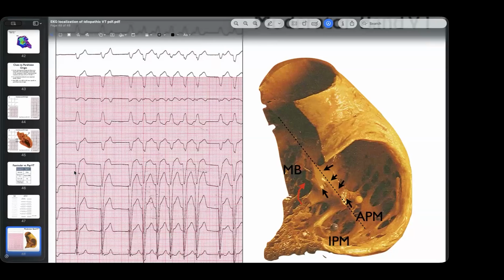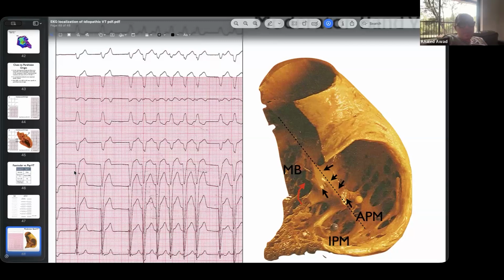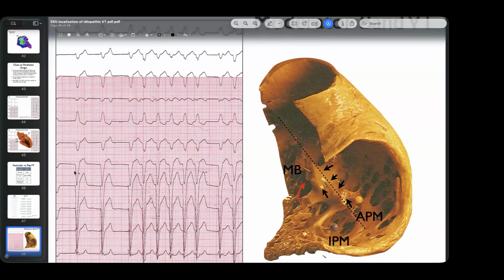Do you use pace mapping a lot? Pace mapping is helpful when you don't have PVCs. That's the only thing you can go by. If you have a lot of PVCs, then there's no point in using pace mapping. Use activation mapping. It's better. Pace mapping is less accurate in the RVOT, better in the LVOT. If you're in the RVOT and you use pace mapping, things have to be identical, not close, identical. And even then, it's not that great.